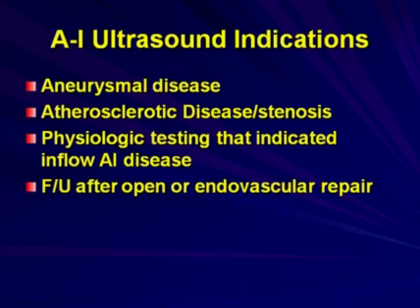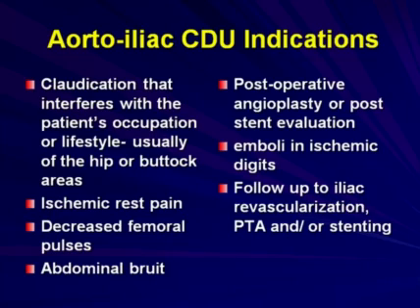The reason that we perform aortoiliac ultrasounds is usually to follow up aneurysmal disease or to identify it. We're looking for atherosclerotic disease and stenoses. Sometimes physiologic testing will indicate that there's inflow aortoiliac disease and we want to define that more precisely, or to follow up after open or endovascular repair.